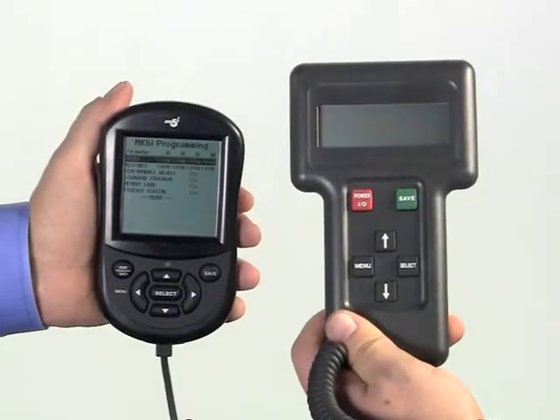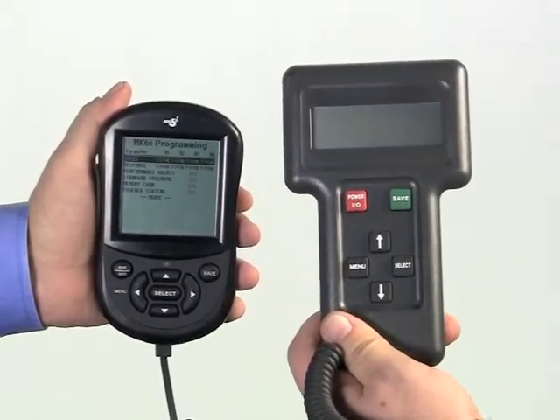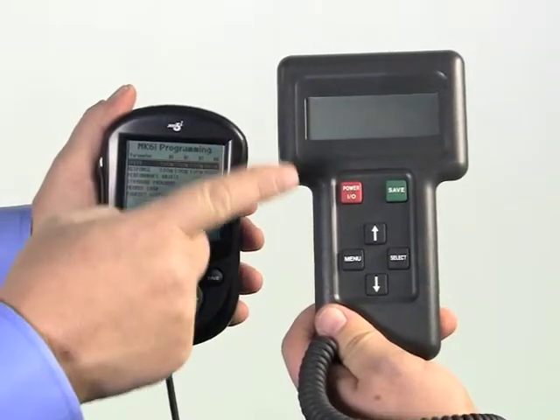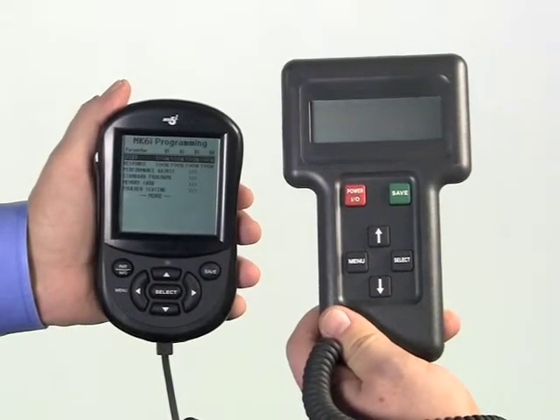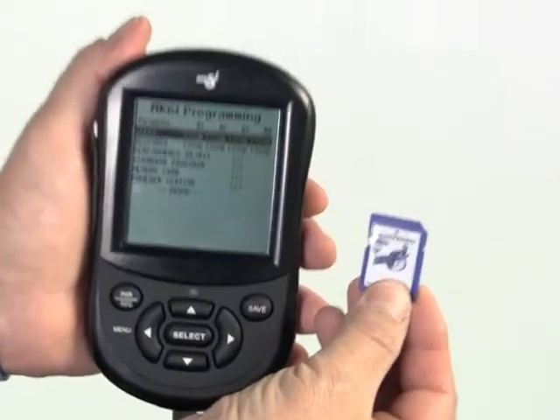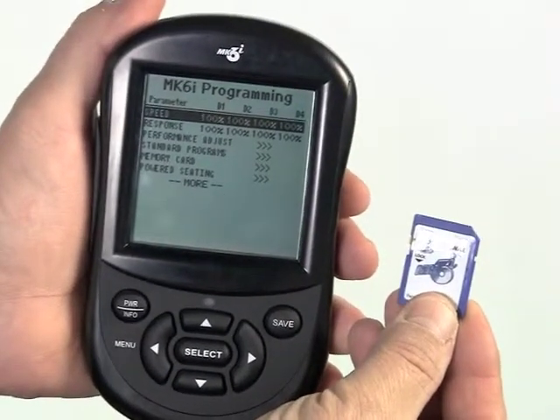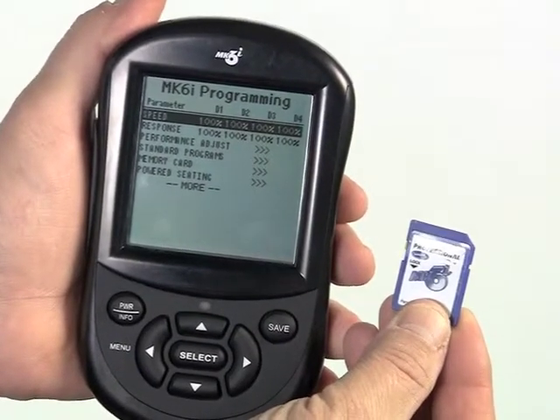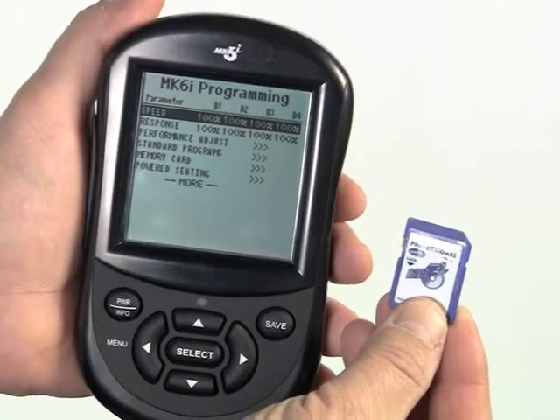There are several choices for programming Invacare power chairs. The most useful and intuitive choice is to use the Invacare Mark VI handheld programmer. An older Mark V handheld programmer does allow full access to all Mark VI programming options. A professional SD card, when inserted into the Mark VI driver control or the display, also allows full access to all programming. Use and features of the Invacare SD card will be covered in another video. This video will focus on the Mark VI handheld programmer.